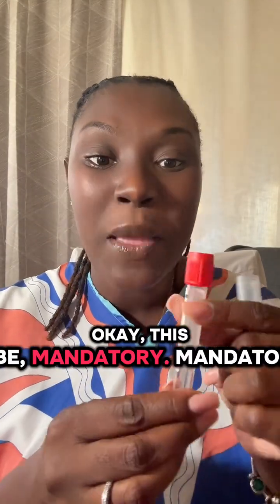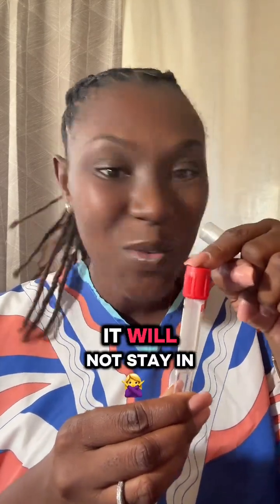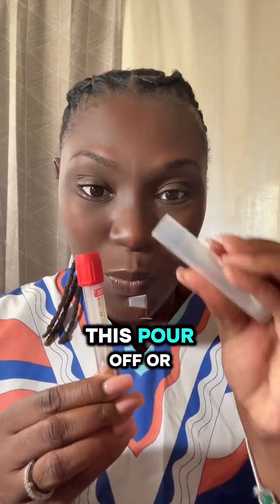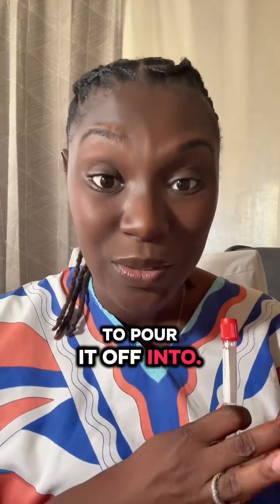This tube, mandatory. Mandatory. It will not stay in this tube. It needs to be spun down. Remove your serum and transfer it to this pour off or whatever tube you need to pour it off into.